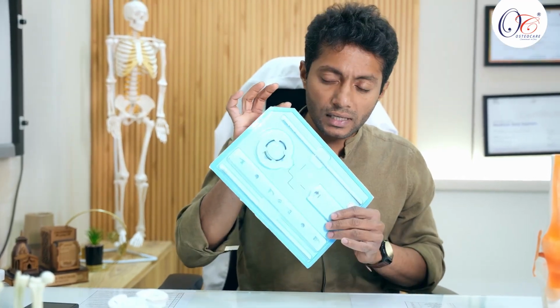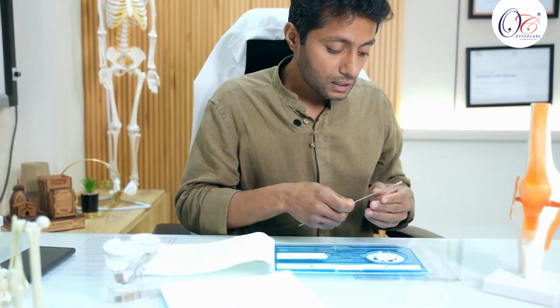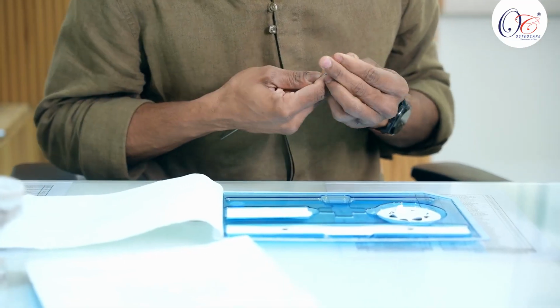Now we are going to discuss a very novel anchor called the RootFix anchor by OsteoCare, which has many advantages compared to the traditional transtibial tunnel repair technique. First of all, we get the entire system as a kit. This is a very nice implant, and the way they provide it is very useful because once we get the kit, it is very easy to handle everything stepwise.